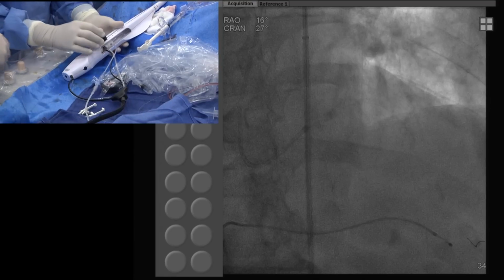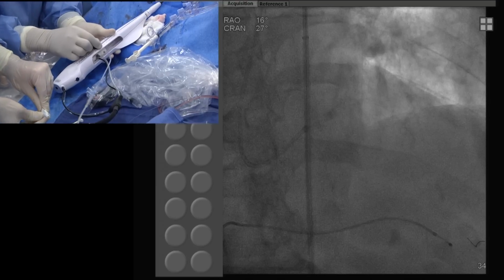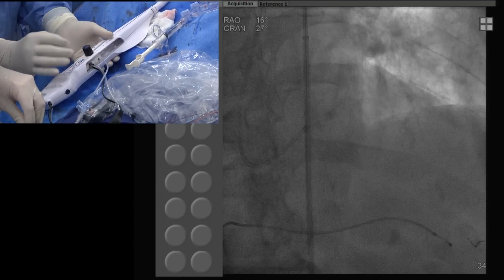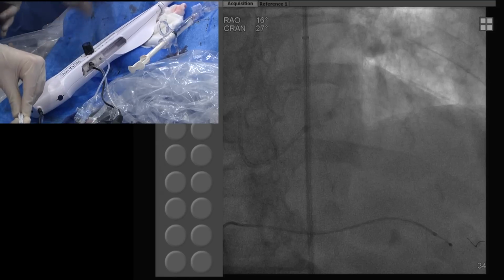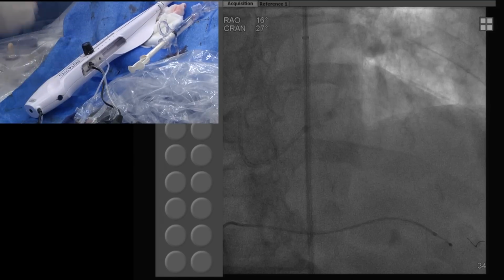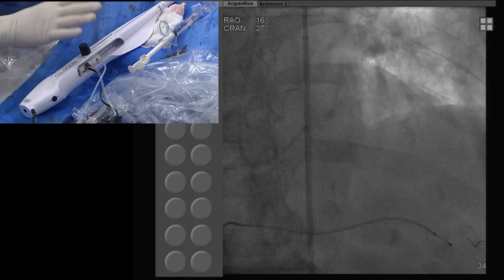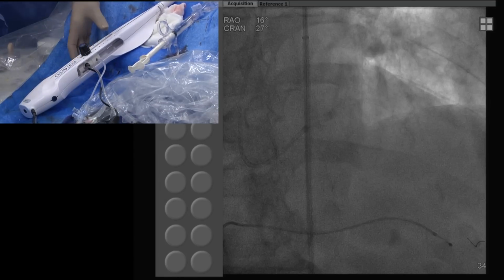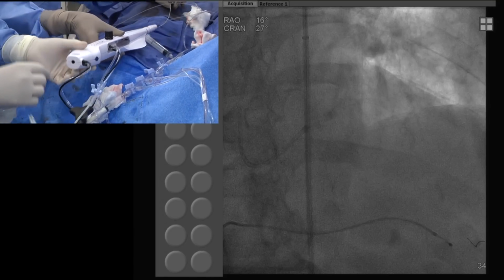The other point which we also saw is that the movement has less friction. So you have to be careful that you don't advance it too much, as it has less resistance. Although, as I mentioned, there are a lot of plus points here, making the whole assembly simpler, a few points need to be changed.